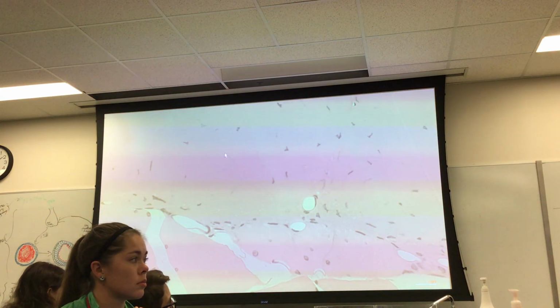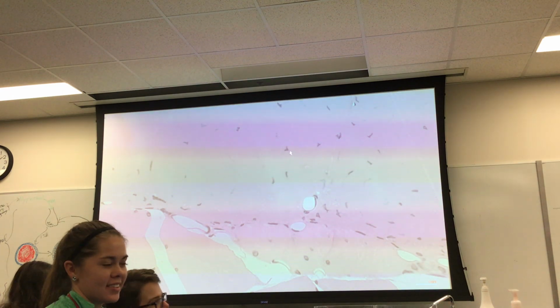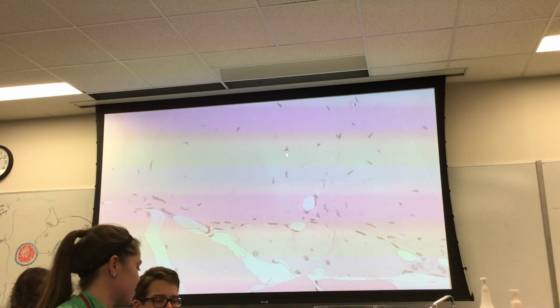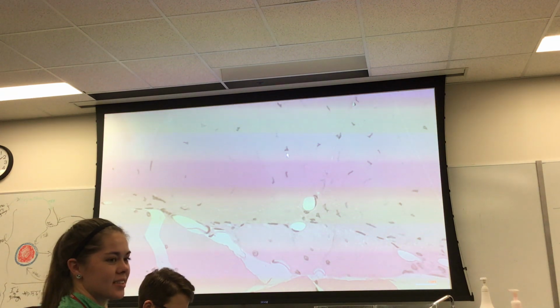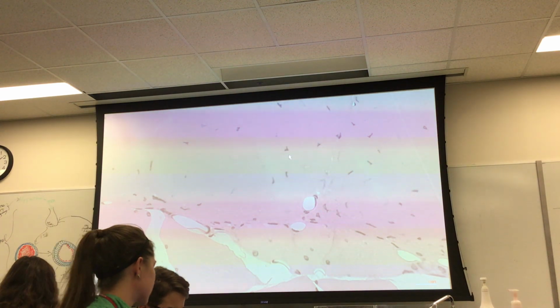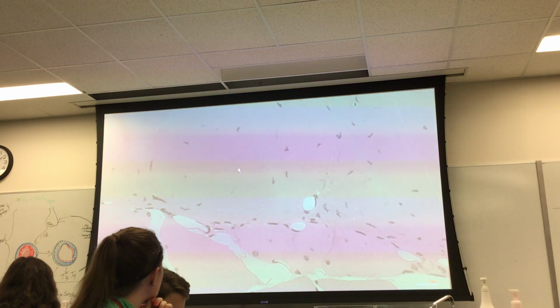I hadn't even thought you'd be confused that this was bone. Sorry, I underestimated you. I apologize. That is not bone, because those cells are not in lacunae, and I will convince you of that in just a moment. It's not bone, but good thinking.